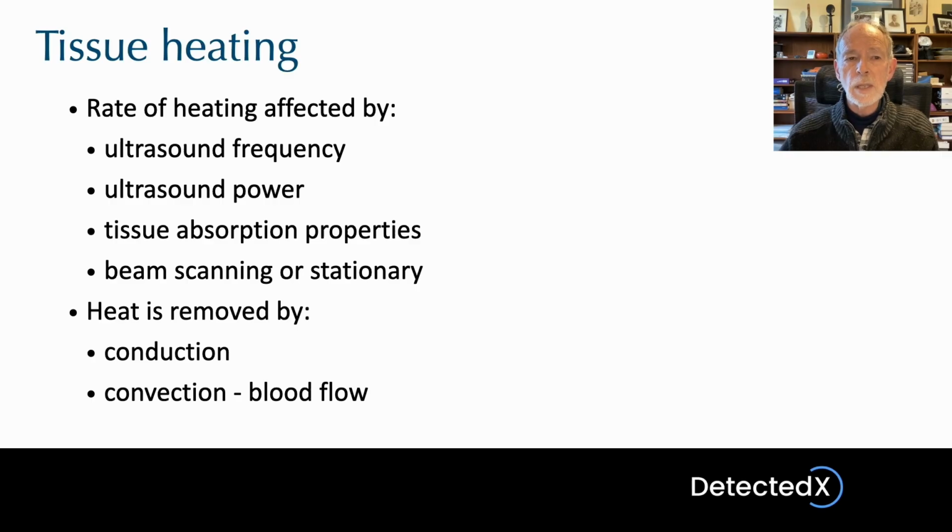than at low frequencies. Of course, the ultrasound power, the actual exposure levels, are going to have a very direct effect on the heating. The absorption properties of the tissue, whether you have normal tissue or whether you have tissue with pathology that makes it unusually absorbent, is obviously going to affect the heating rate as well.